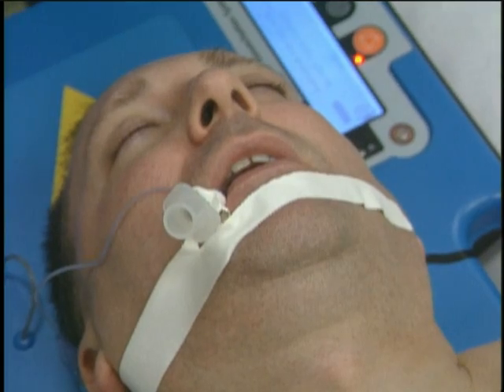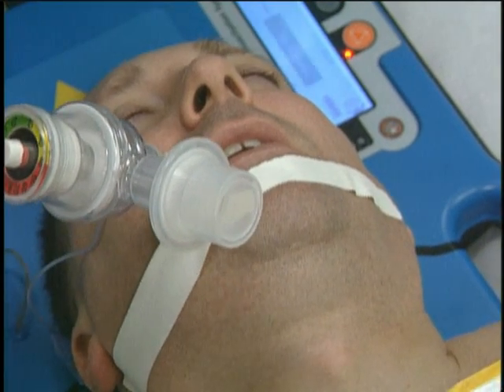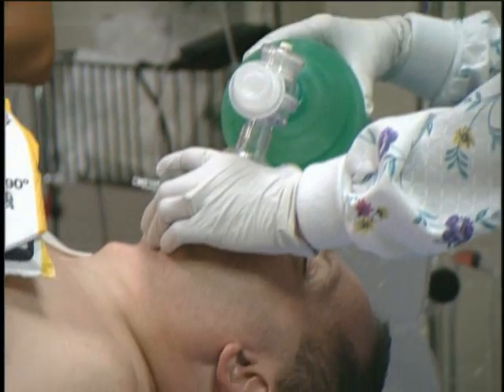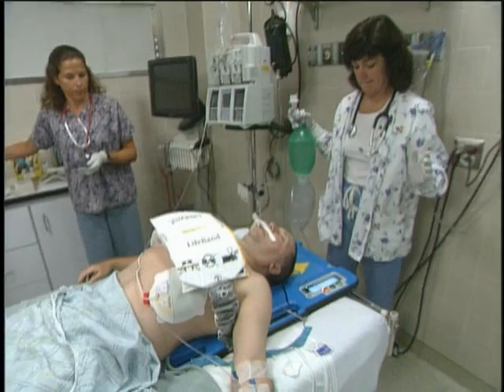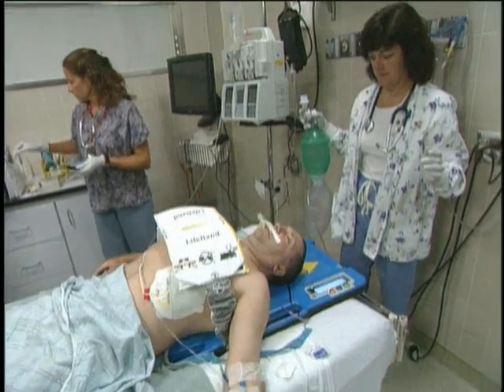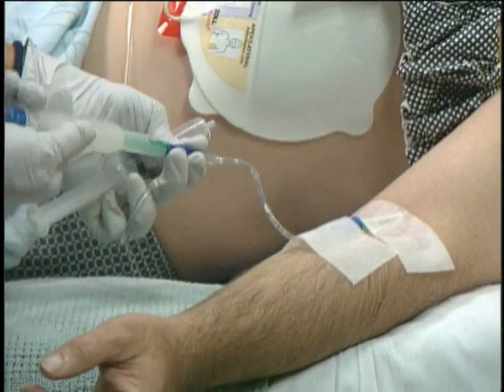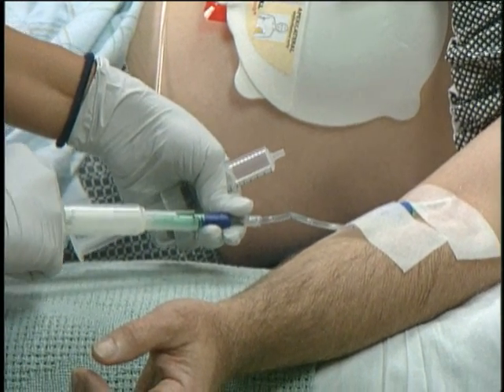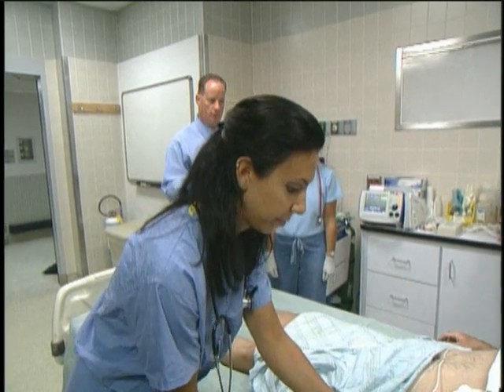Let's restart it. Get ready to defibrillate at 200 joules, please. The auto pulse is on continuous. We have a pulse. Do we have capnography and tidal CO2? We're ready. Clear. All clear. Shock at 200 joules. One milligram of epi. Let's circulate that, please. I'm giving the epi right now. This is the first epi.